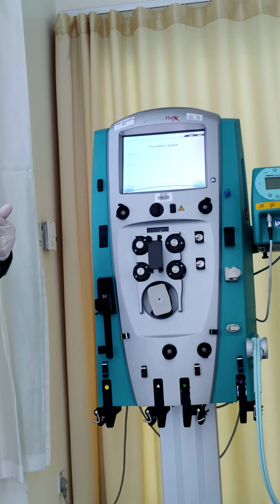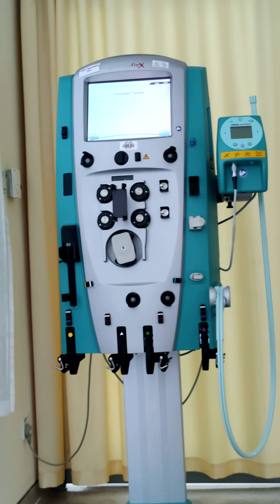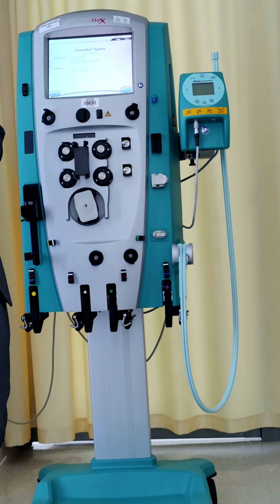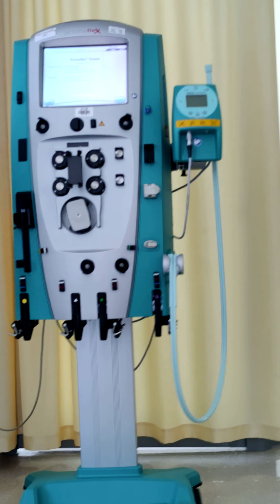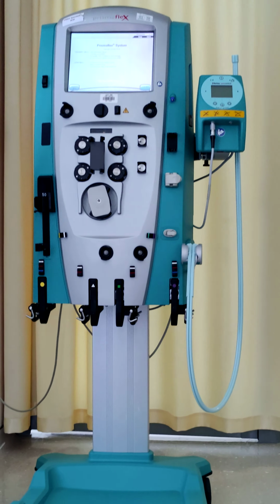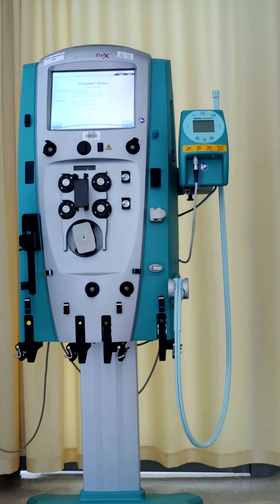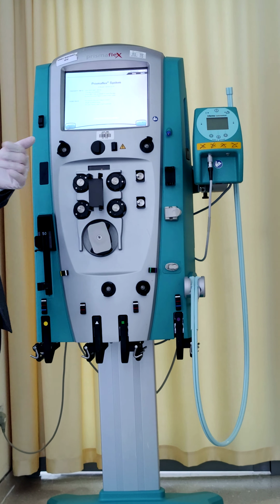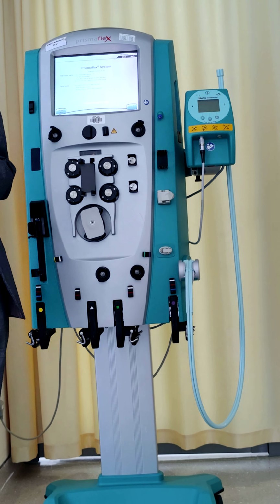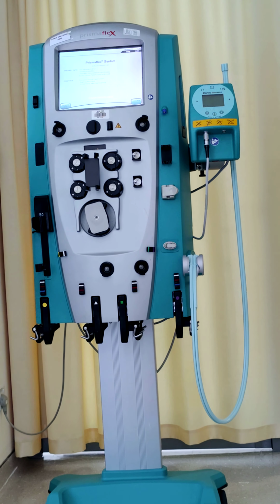If you have an obese or heavy patient, like 100 or 120 kg, you may need more than 3 hours, maybe 3.5 hours. I think your patient is around 60 kg, right? Approximately 60. He planned albumin only, not plasma. I'm not sure.